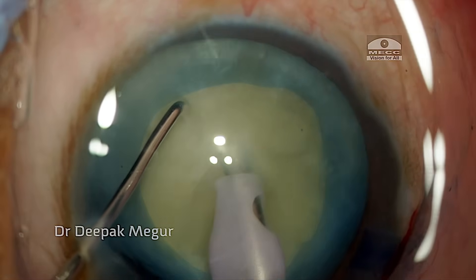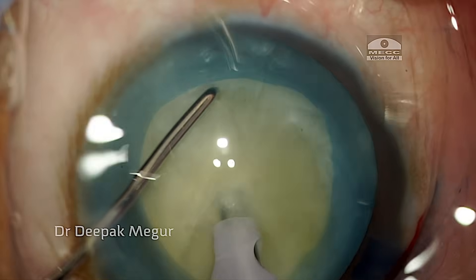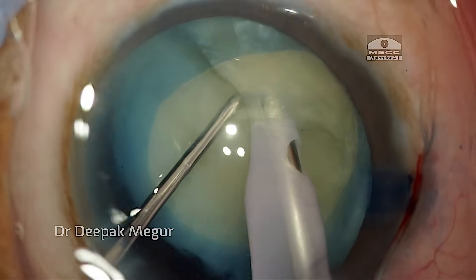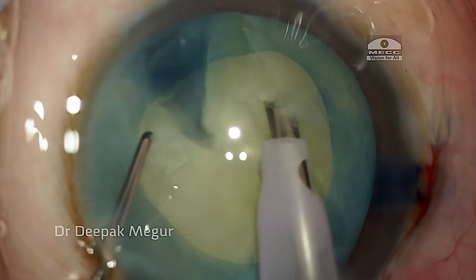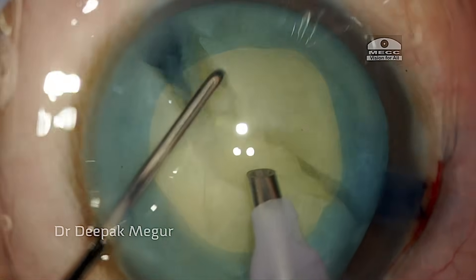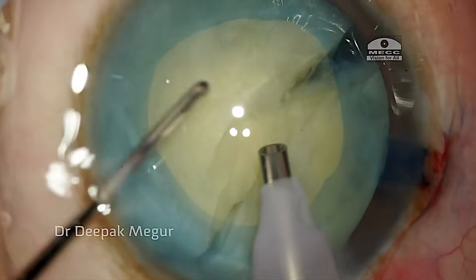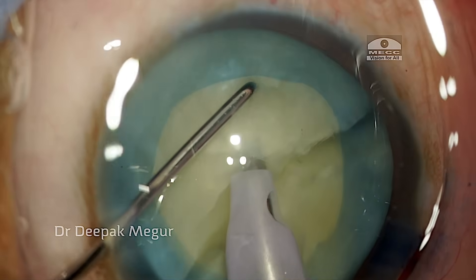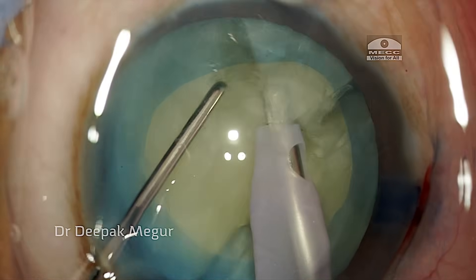Once we have a rhexis of about 5 mm, we proceed to nucleus management. I am performing a vertical chop using a sharp chopper. The phaco tip is buried in the nucleus, the nucleus is slightly pulled anteriorly, and then the chopper scores vertically.